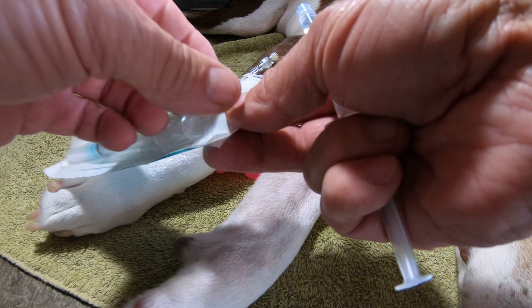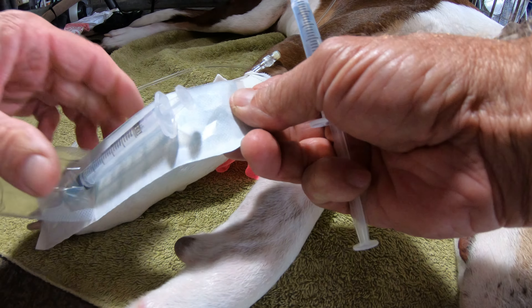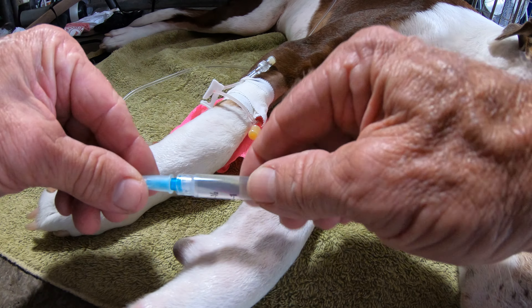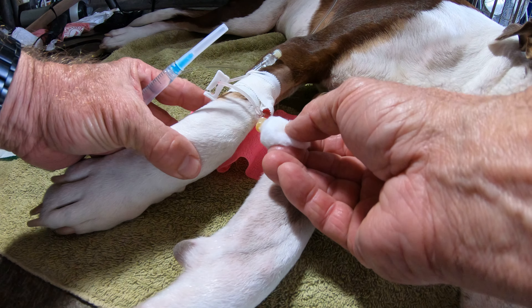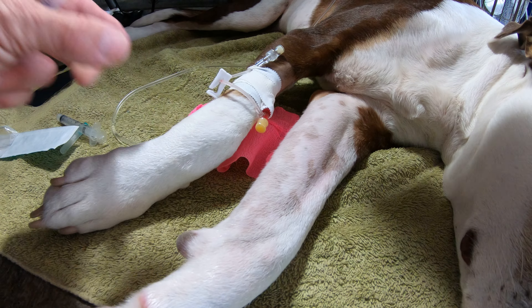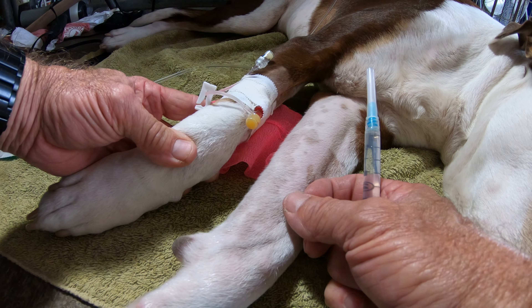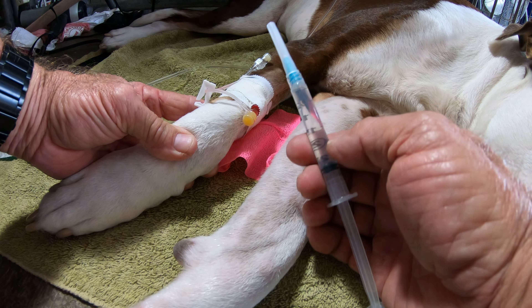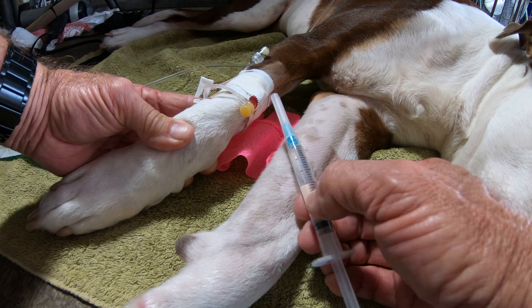I'll open up another syringe and take the needle off of it. I'm going to re-sanitize the injection port on the catheter. I'm using 91% isopropyl alcohol for that, and I've got this lactated Ringer's solution in this syringe ready to go. I'll let the alcohol dry just for a second and then I'm going to flush this catheter.